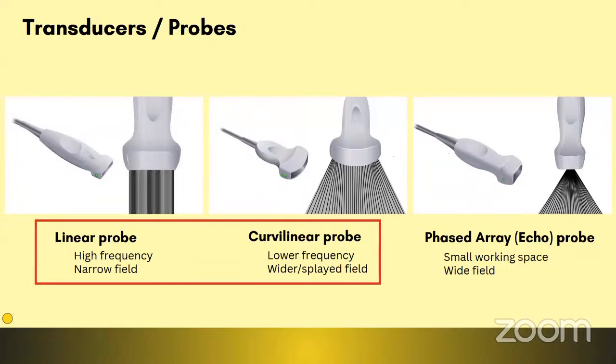These ribs don't allow ultrasound pulses to enter deeper because, as we saw earlier, bone has high acoustic impedance, being much denser than other tissues. In that case, I would use the linear probe because I can keep it in between the ribs, which is the intercostal spaces. And also I can see the superficial structures, which are the pleura. So that would be my primary focus here.